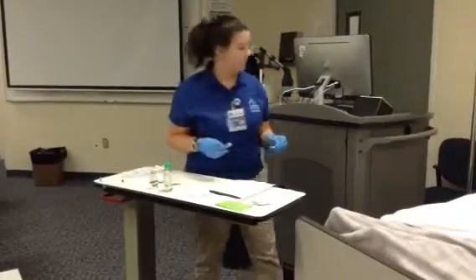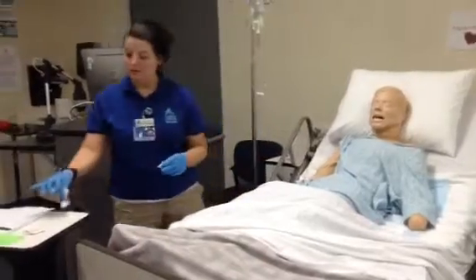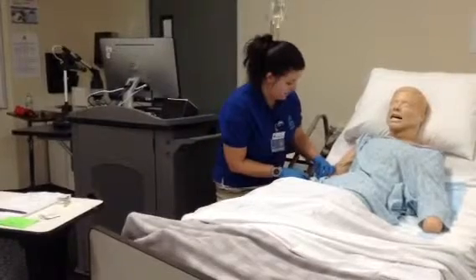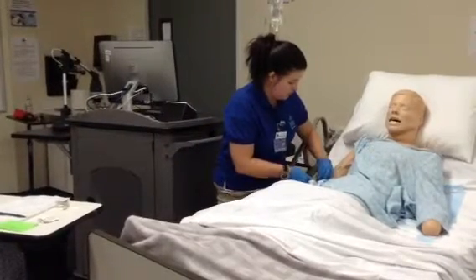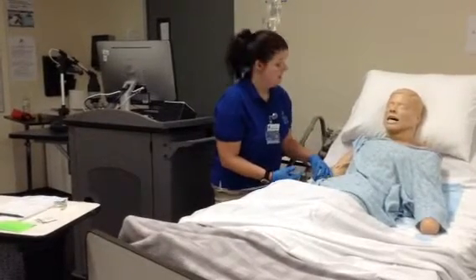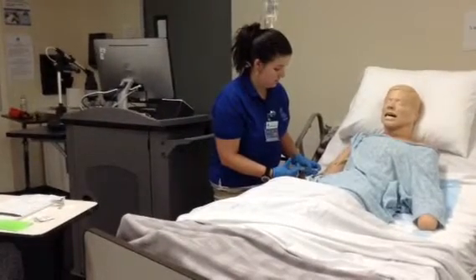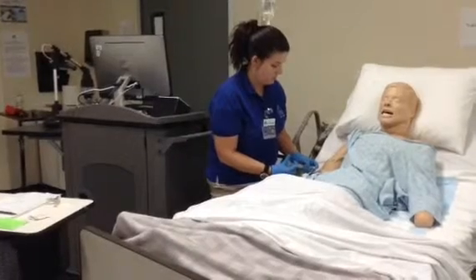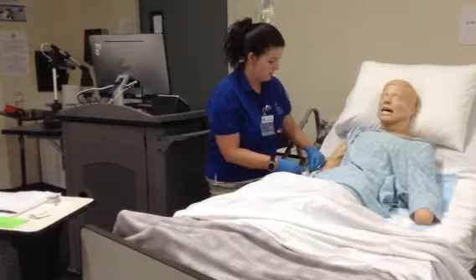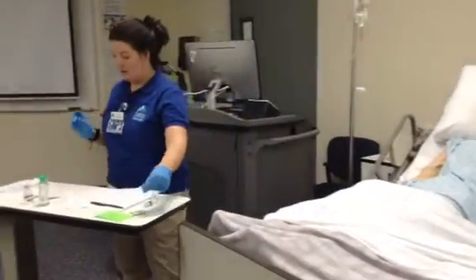Now I would come over here and observe my site again. No phlebitis, infiltration, or anything like that. Clean the port. Alright. And then stick my syringe on here. Aspirate. And I got blood return to verify my placement. And then I'm going to administer just 3 milliliters. Alright, and my 3 milliliters is administered. Okay, come back over here.